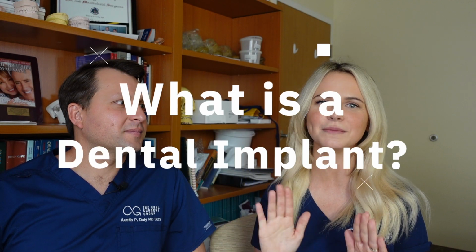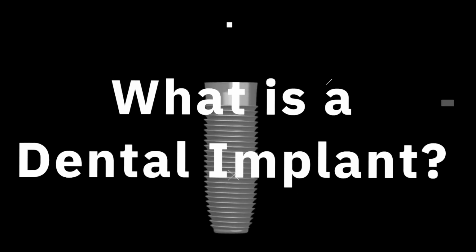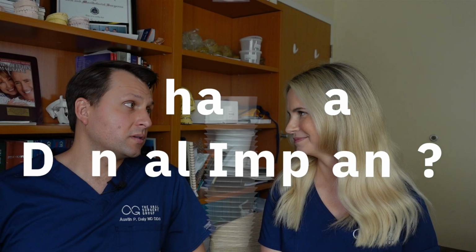So let's start at the basics. What is a dental implant? So when a patient loses a tooth, a lot of times we want to replace that tooth. There's a lot of different reasons we want to replace that tooth. If it's a front tooth, there's aesthetic reasons. Obviously, we don't want to be missing a front tooth. No. If it's a back tooth, it's important for chewing.